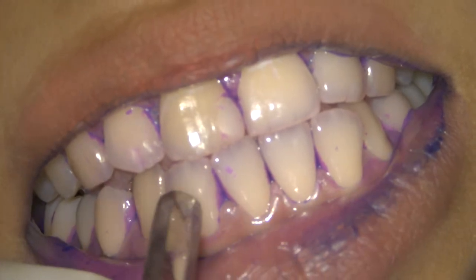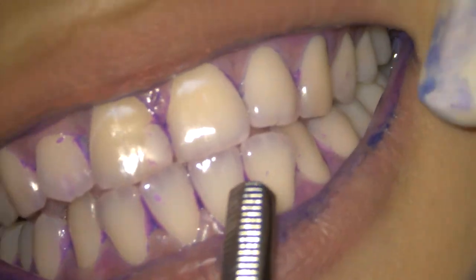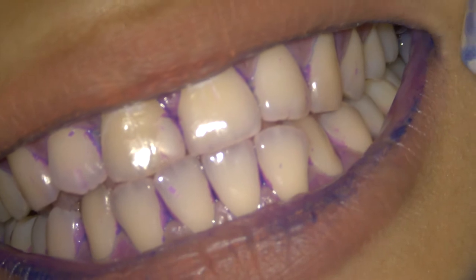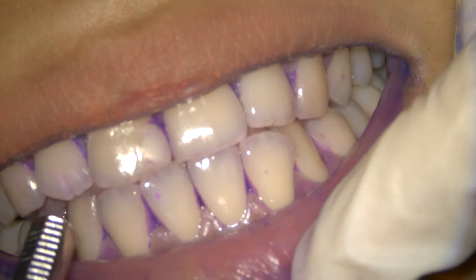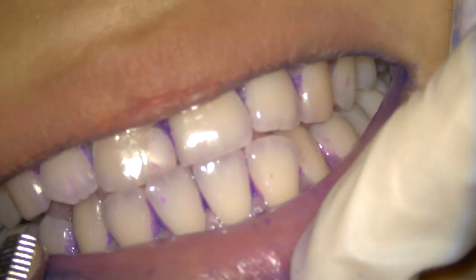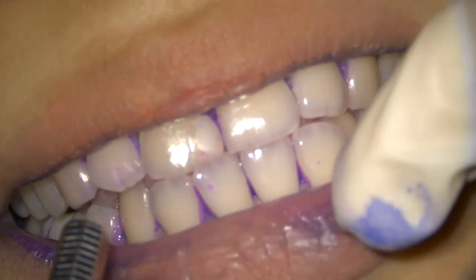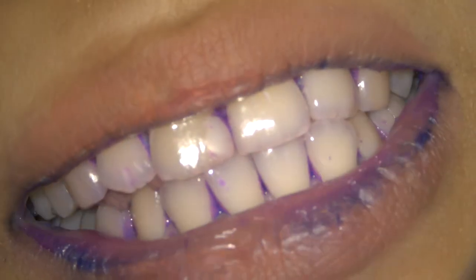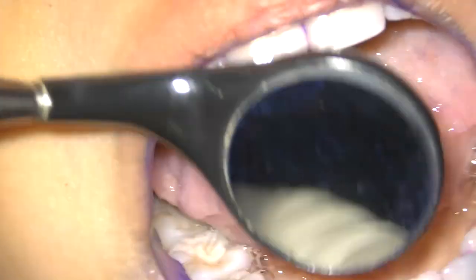In fact, the buccal surfaces usually have very less plaque compared to the interdental and the lingual surfaces. You can see some plaque here, and even here in between — this stained plaque. This is a two-tone solution, so this pink color indicates it is a freshly formed plaque or a new plaque — it is not a very mature old plaque. That means the patient has been cleaning every day and this plaque has formed maybe in a few hours. Let us see how her plaque score or plaque presence is inside the lingual area.